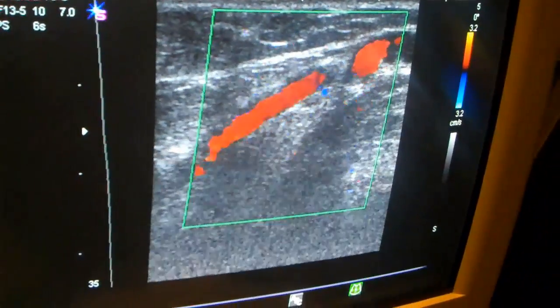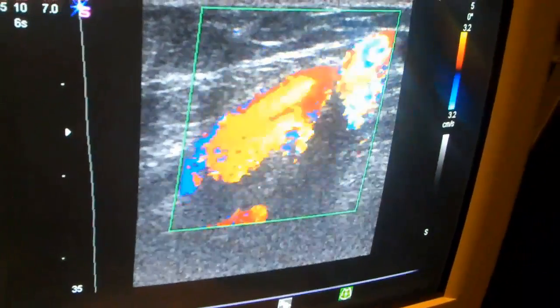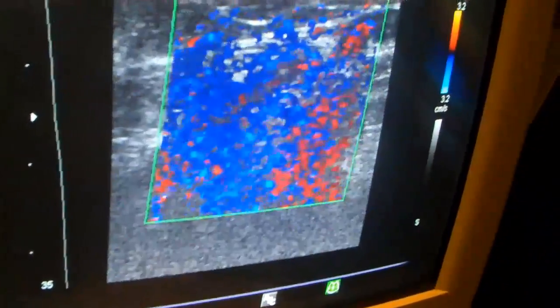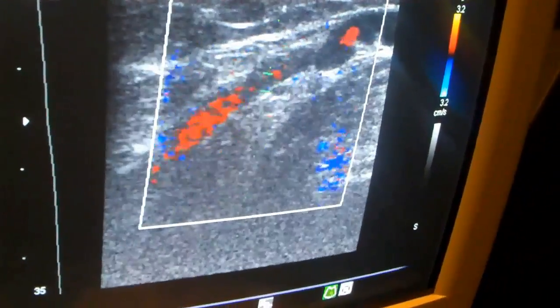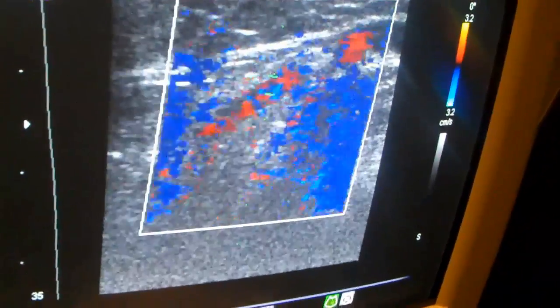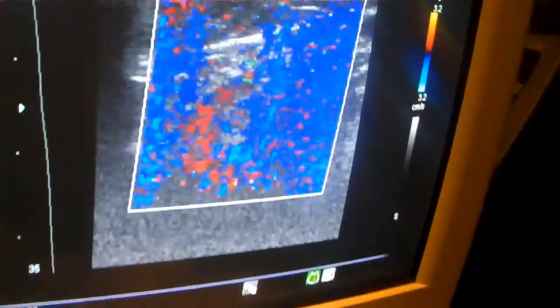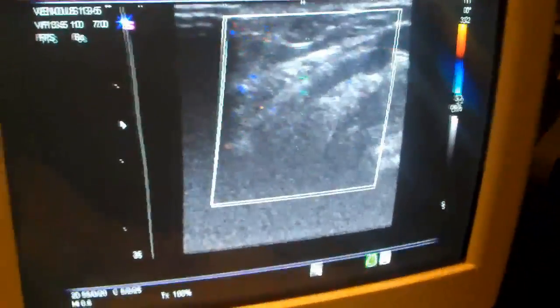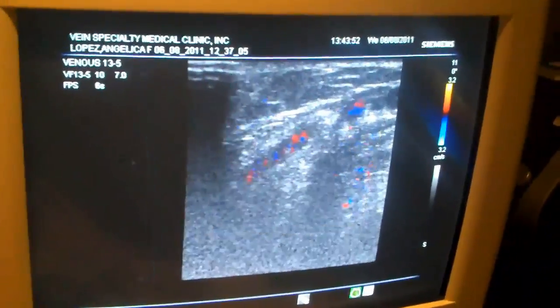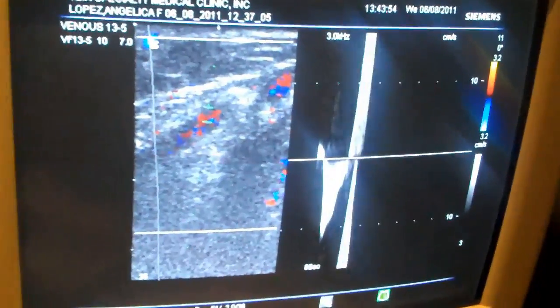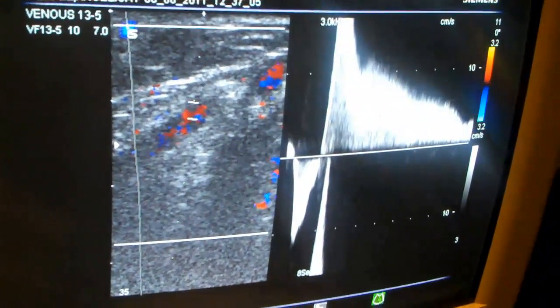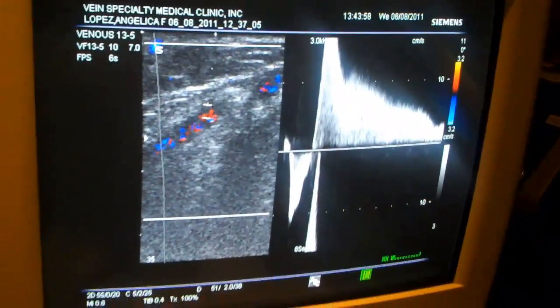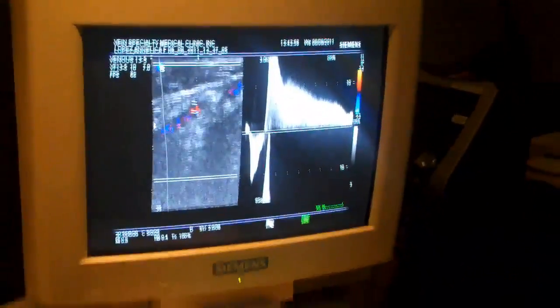You can see this vein has very severe reflux. This is really the reason for her symptoms. As you can see, this vein has very severe reflux, and this is the cause.